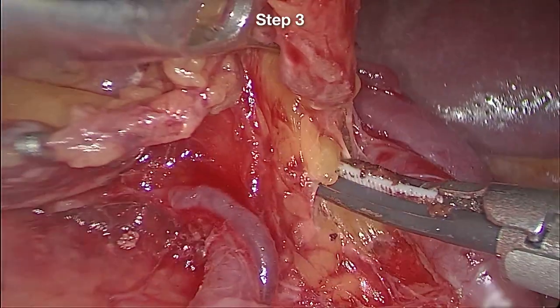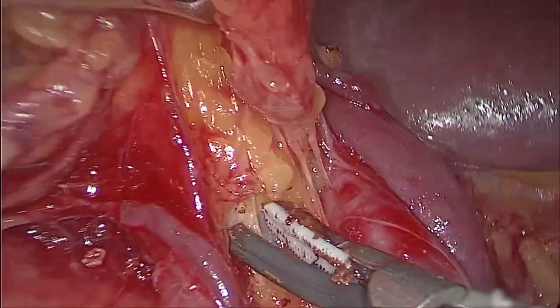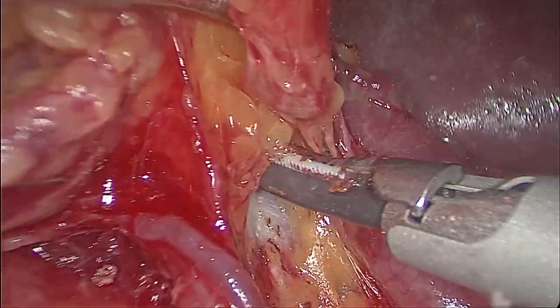Step 3. We skeletonized the superior splenic lobar arteries near the upper pole of the spleen.